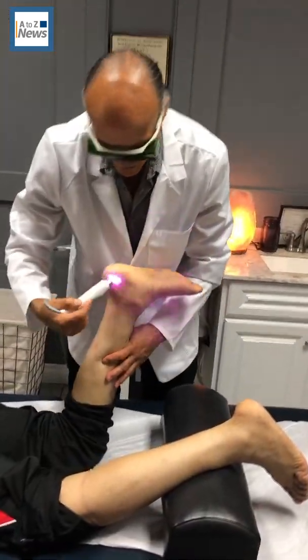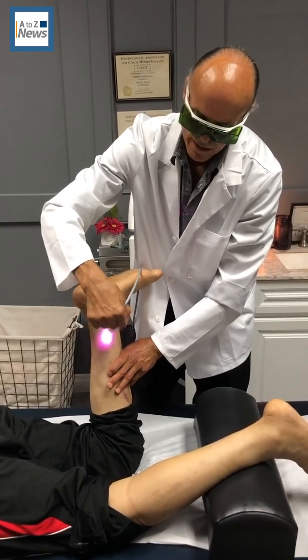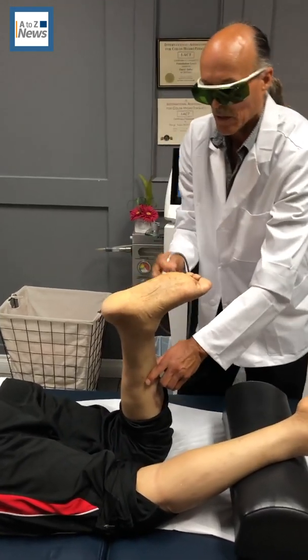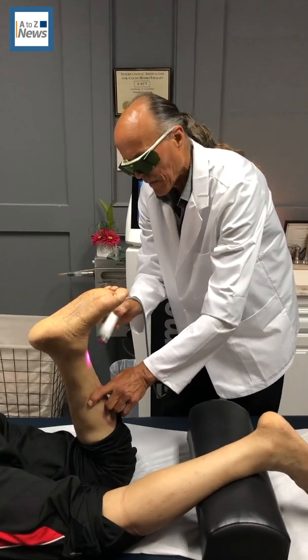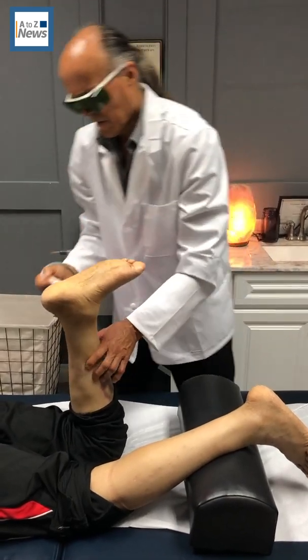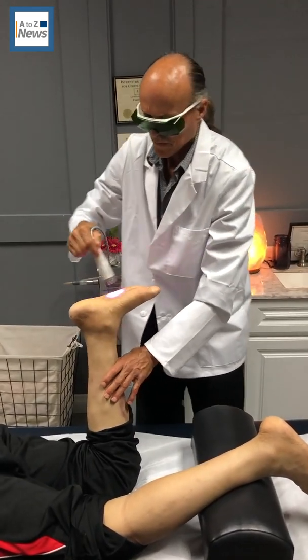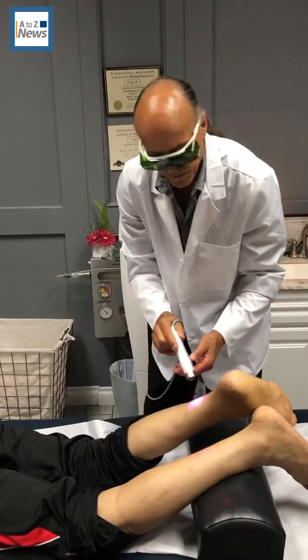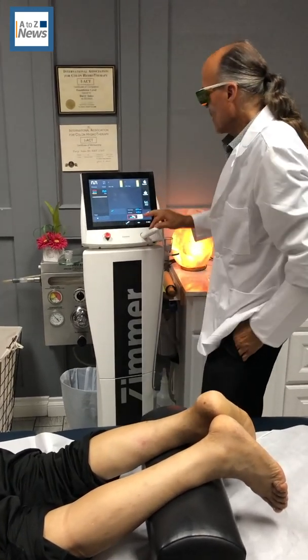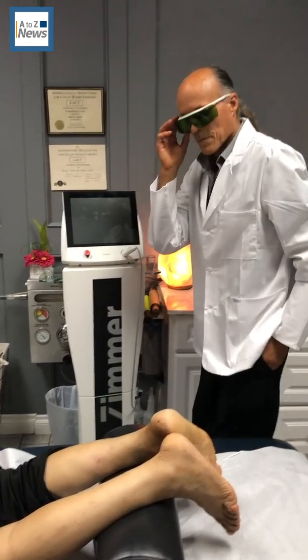The laser has been a great addition to the office — you don't have to move the injured area, it's not painful, and patients see the effect. In acute injuries it's too painful to move and they don't like being aggravated, so it's the perfect modality to use. We're going to wrap that up there — closing it down is just a few buttons and it's done.